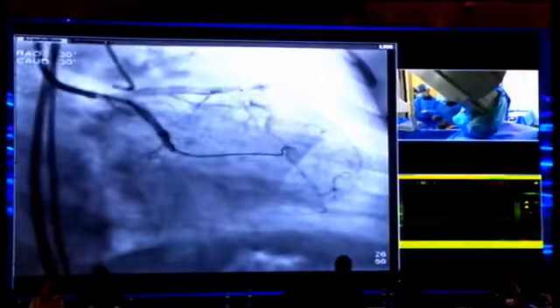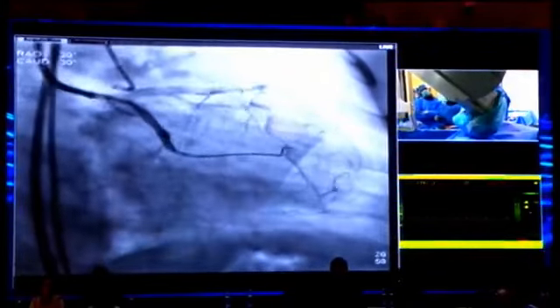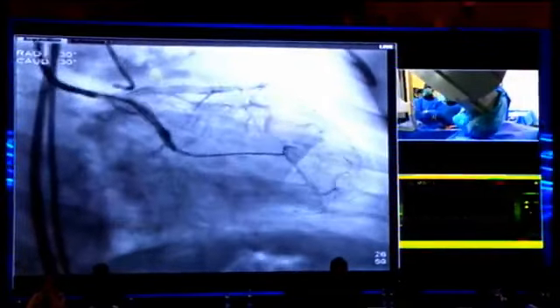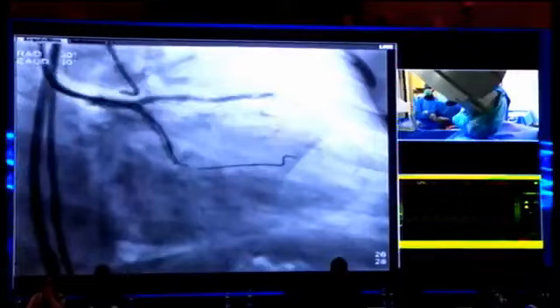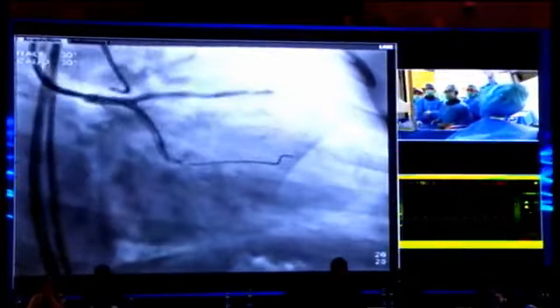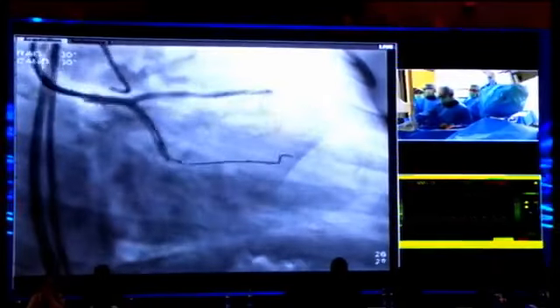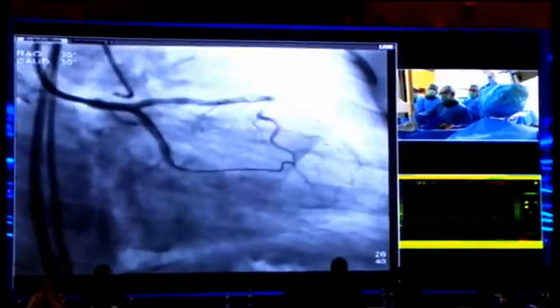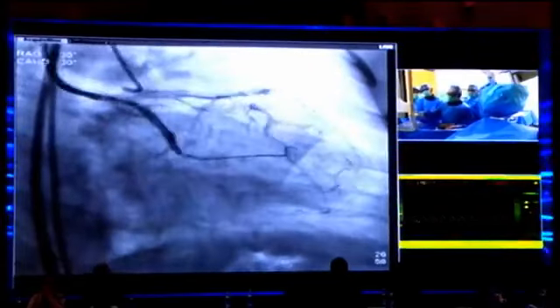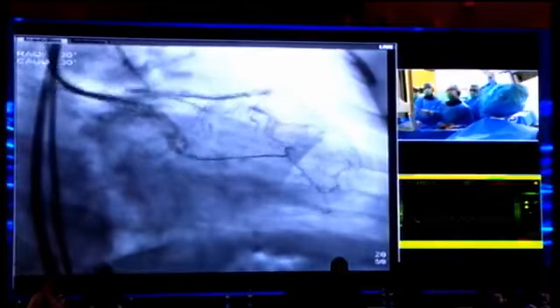Firstly, from the CTA angio, there is no significant microchannel and no severe tight calcification, but I tried using the XTR guide wire, and it failed. I stepped up the guide wire from the XTR to the Gaia first, but it very easily prolapsed to the distal PL branch.